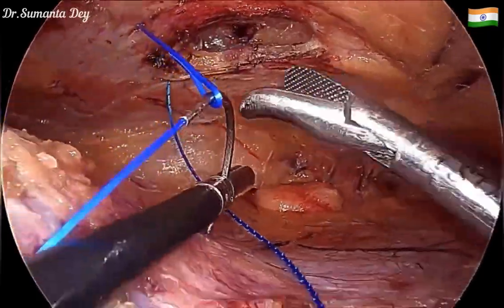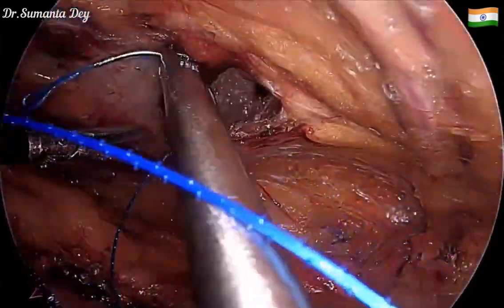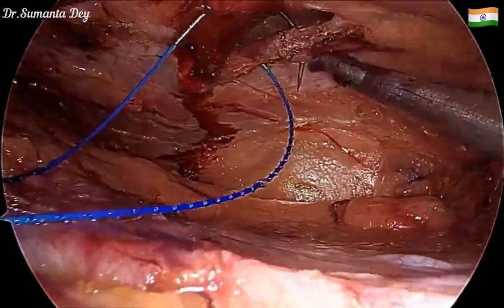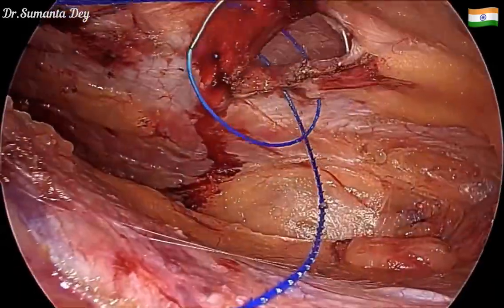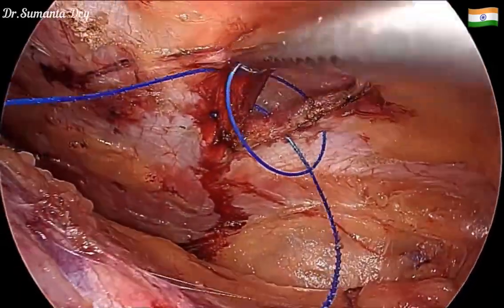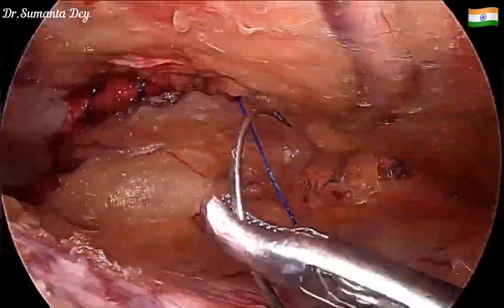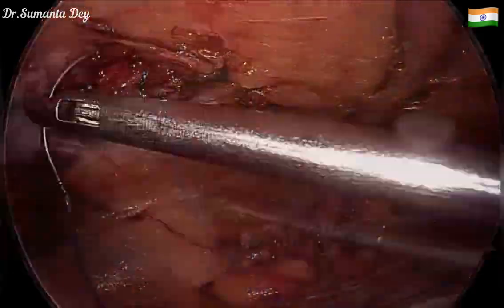Closure of the hernia defect is done using a 1-0 non-absorbable Prolene suture in a continuous manner. All hernia defects should be closed nicely — this reduces the chance of mesh migration and pseudo-hernia formation.